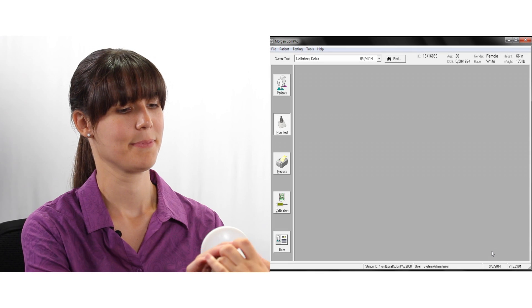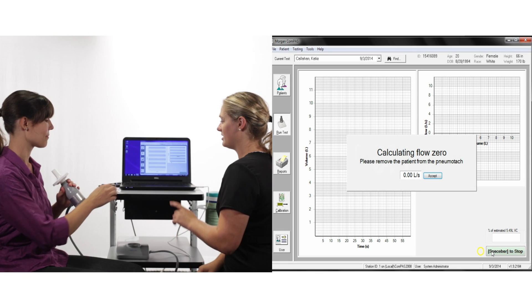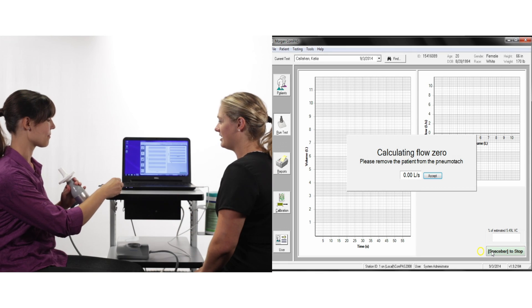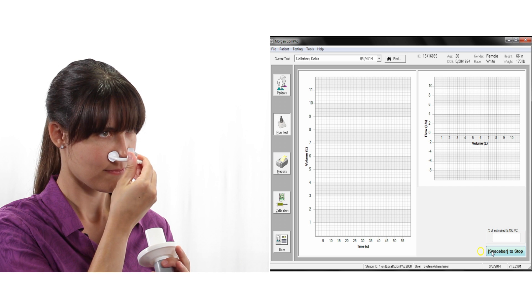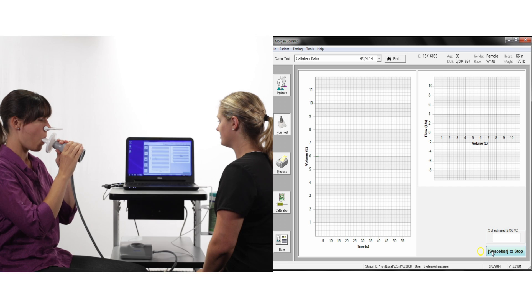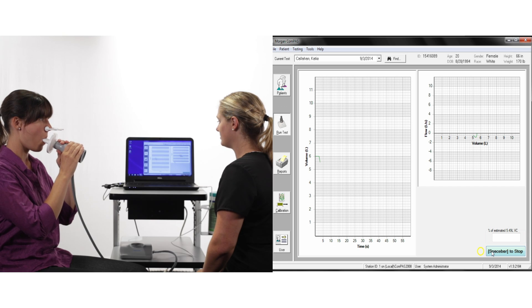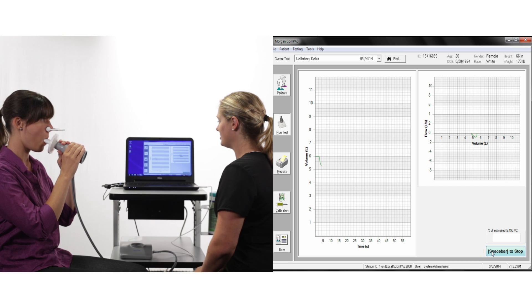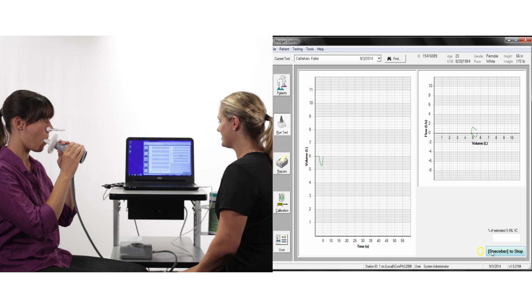To begin flow volume, make sure the subject is sitting upright and wearing a nose clip. To start the test, press the spacebar and encourage normal tidal breathing.